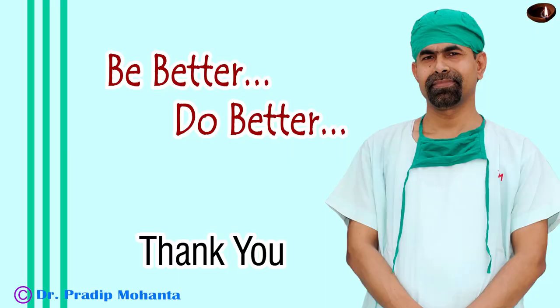The superior rectus bridle suture is cut and the speculum is removed. I hope this video will help you in learning SICS. Thank you very much for your attention. Be a great surgeon and serve your patients with love, respect, empathy, and great surgical competence.